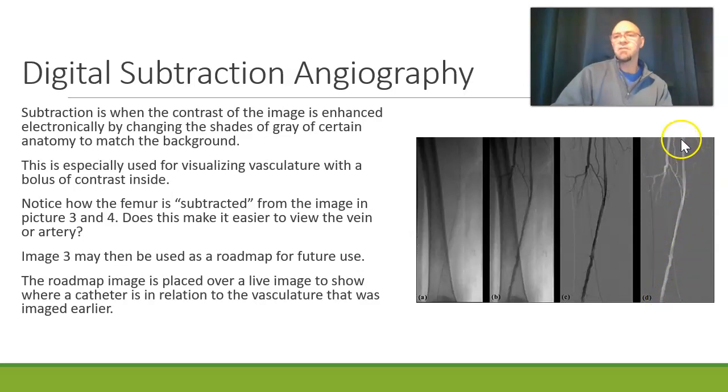So that's what it would actually look like. And then we invert it. So whenever we do fluoroscopy, we see the barium go down a person's esophagus as a black globule or bolus of contrast. Well, that's already inverted, because if it was absorbing all of that X-ray, it would be white, right? So I just thought I'd point that out to you.